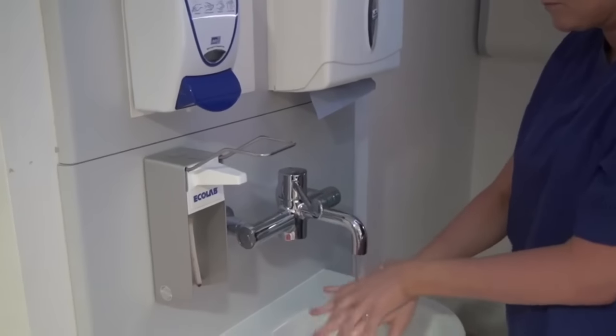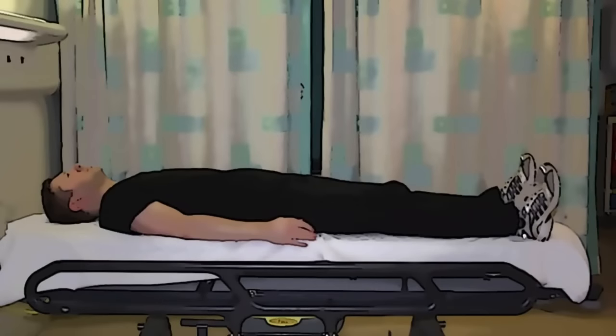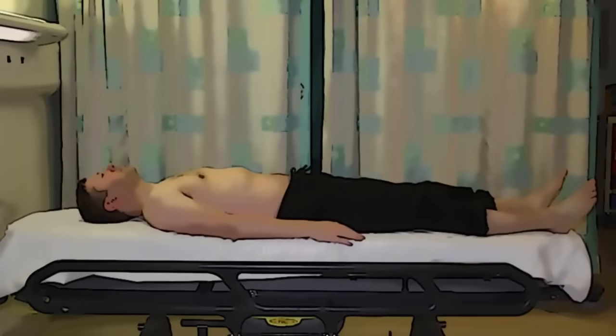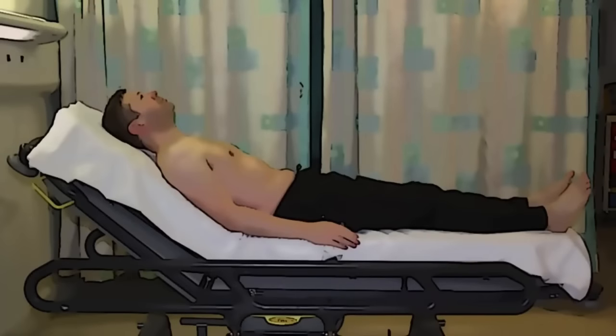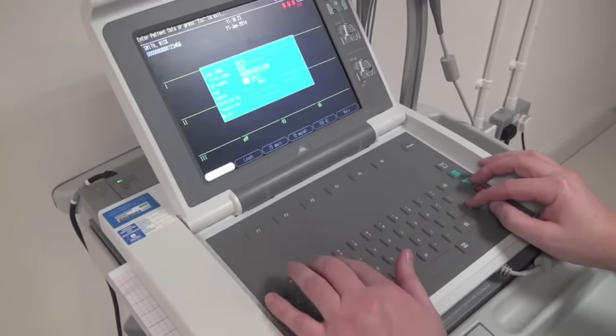As always, don't forget to wash your hands at the point of patient care. Ask your patient to undress from the waist upwards, including bra if necessary. Socks and tights should be rolled down or removed so that you can get at the lower legs. The patient should be positioned where possible flat or in a semi-recumbent position and comfortable. They should remain covered whilst you enter the patient's demographics into the ECG.